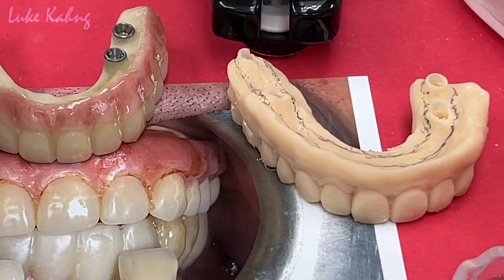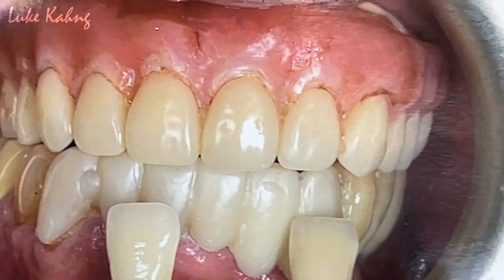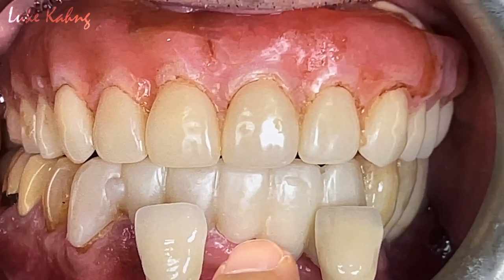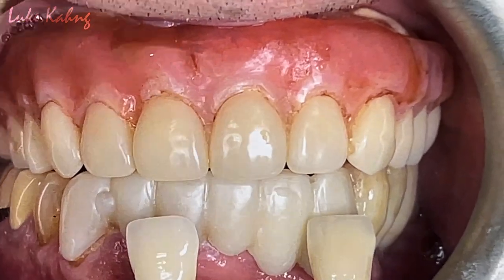Here's the story for this, which is the patient had previous nice dentures. That one is our guideline. The shape, contour, and design were there. Looks like the lower is a temporary to me. So this is what we built.